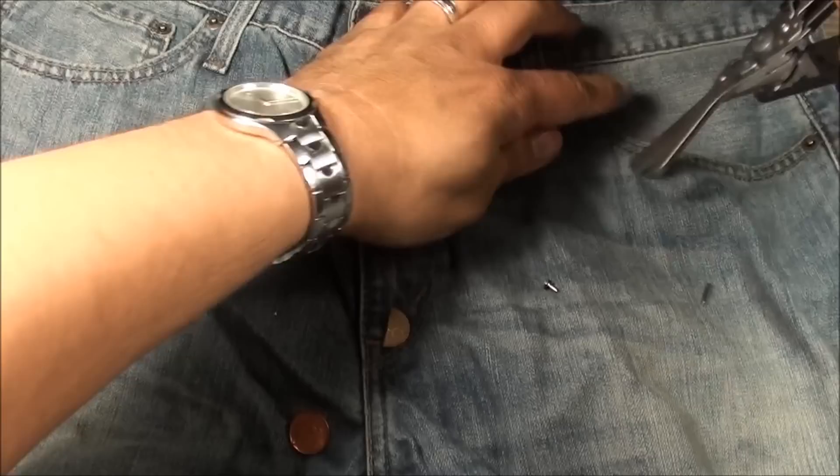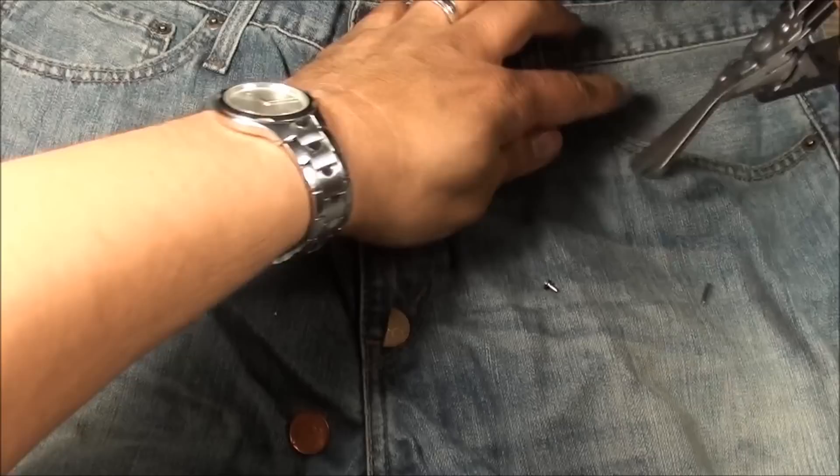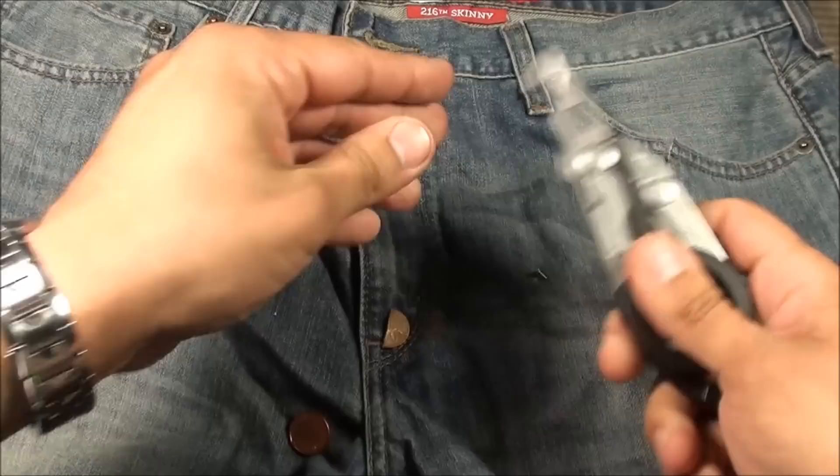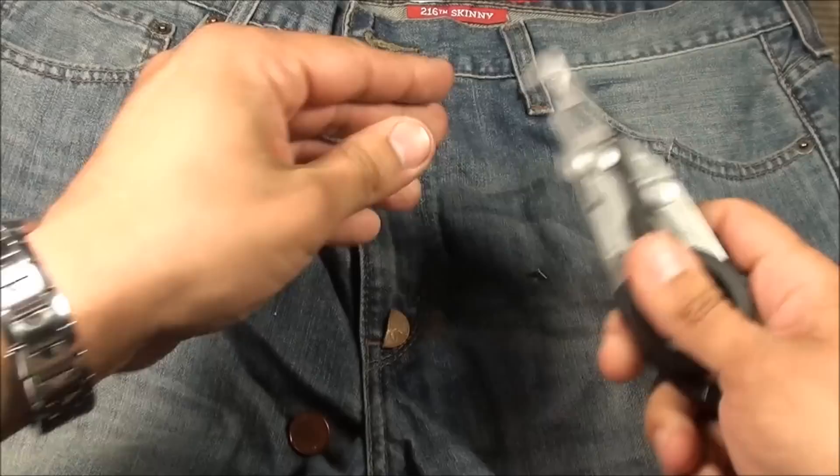You could also use it for jeans, for example. If you wanted to, you just flip it over and use the seat belt cutter portion of it. Just go right through those jeans, get in there, and attend to an injured leg, for example. These things are really impressive — the cutting power on them. No joke.